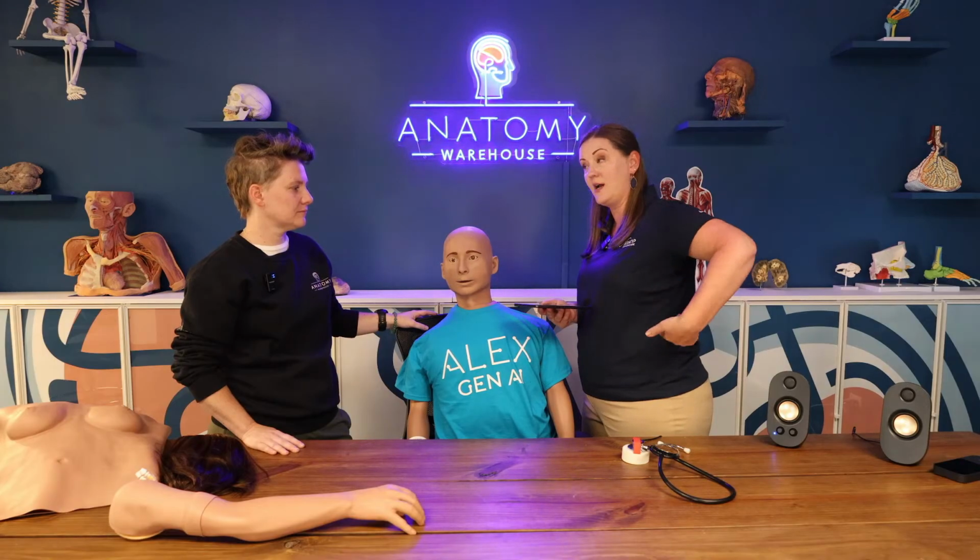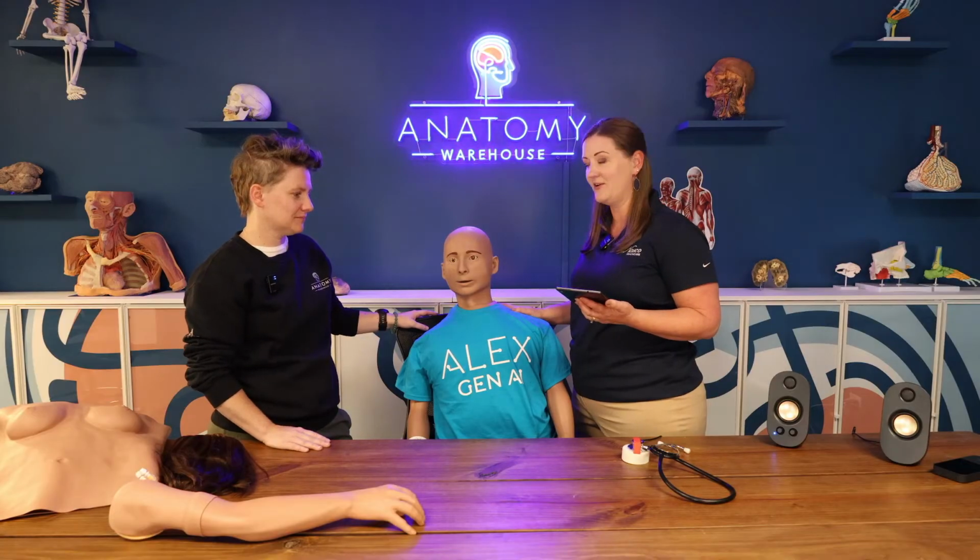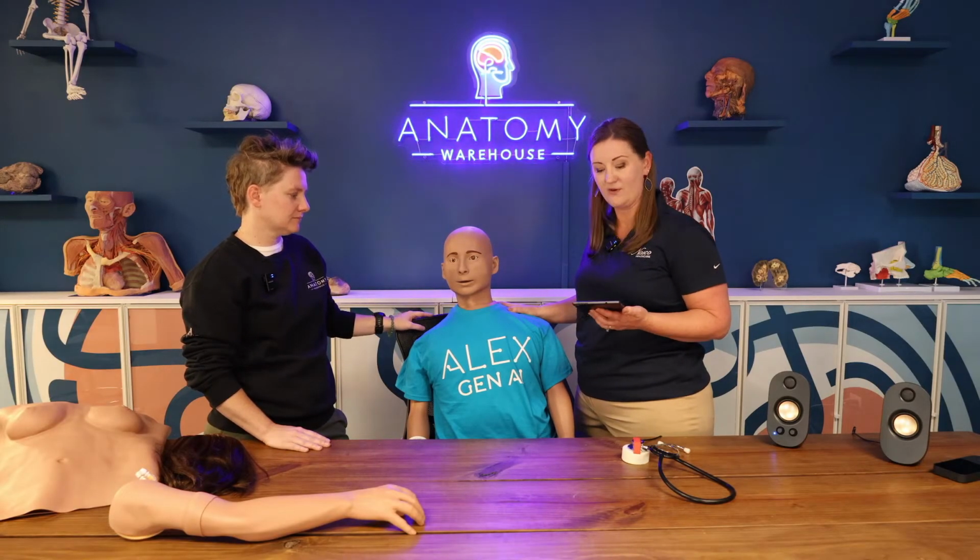The thing that you can do to prevent that and prevent any of these issues is he does have a port on his side. Classic Ethernet. You can hardwire this guy straight into the internet, and then there won't be any connectivity issues at all whatsoever.